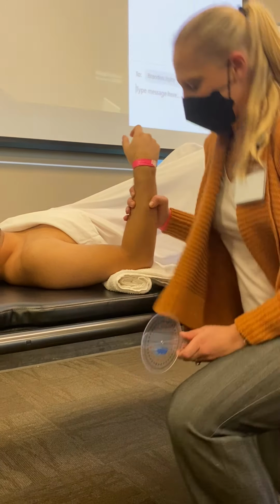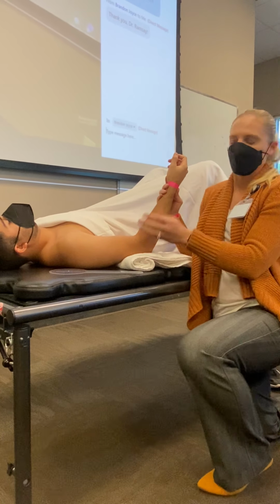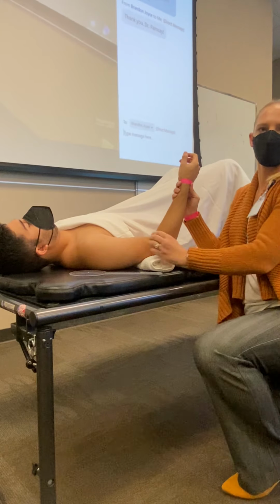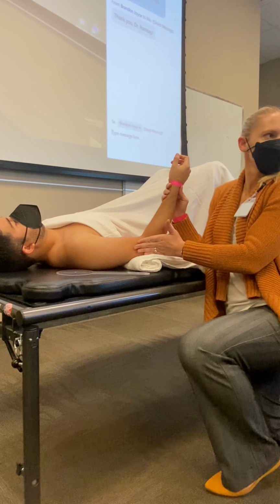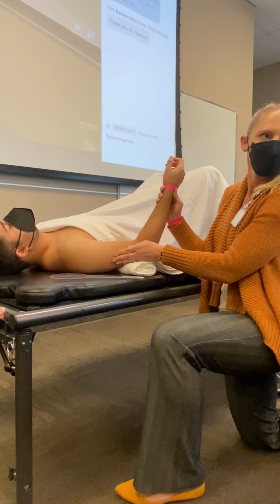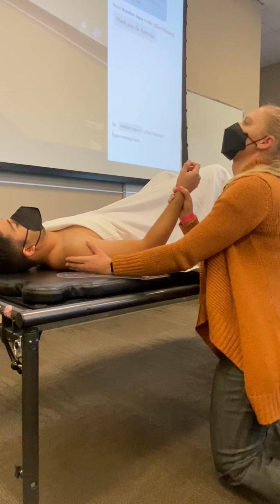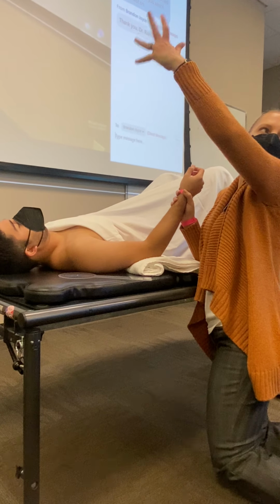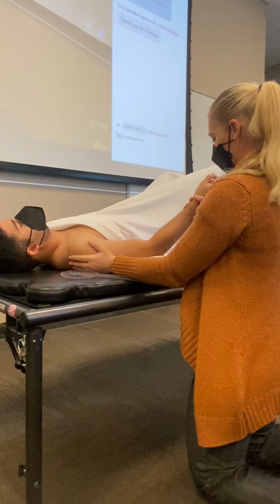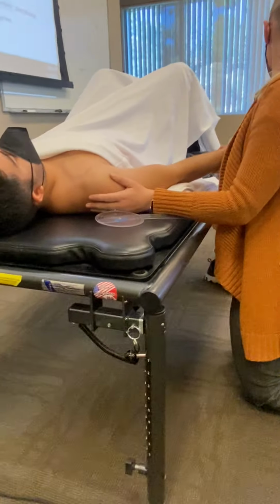The fulcrum is going to be your lateral epicondyle, your stabilizing arm is up towards the acromion, and your moving arm is toward the radial styloid. For elbow extension, the towel is really doing most of the stabilization, so you can either palpate at the shoulder or keep your arm here at the elbow, whichever you're most comfortable with. Relax, remember to breathe. And again, I would also bring the table up so that I'm not squatting down. What kind of end feel would I expect with elbow extension?